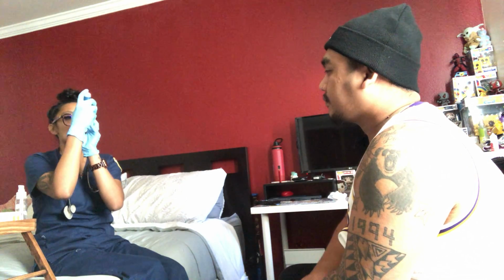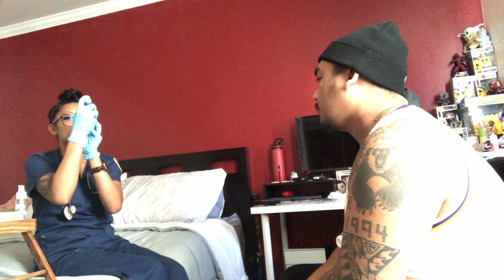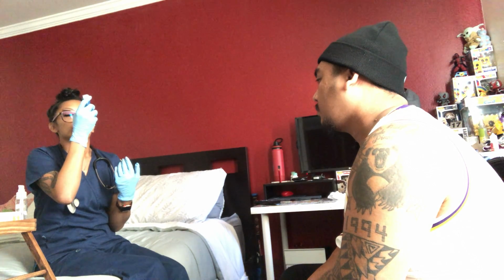What you want to do is completely breathe out, and then whenever you're ready, hold your head up at a 45-degree angle, hold it to your mouth, press the actuator or press the canister, and once you press it, you're going to hold it for at least 10 seconds, and then breathe out slowly. The breath in that you want to take is a very slow but steady one so that the medication does get deep within your lungs.